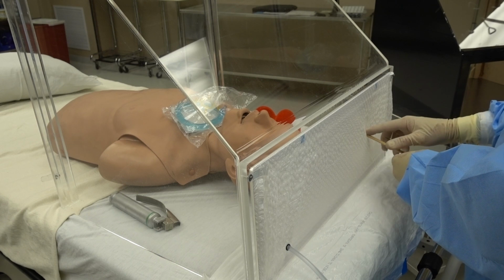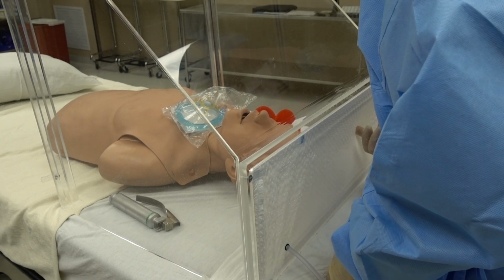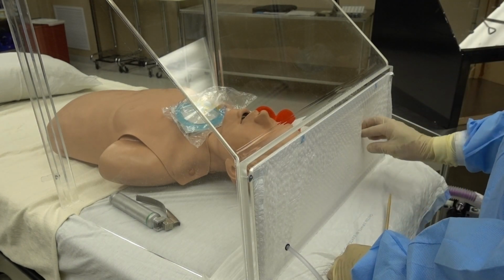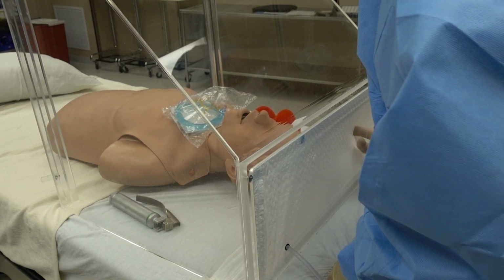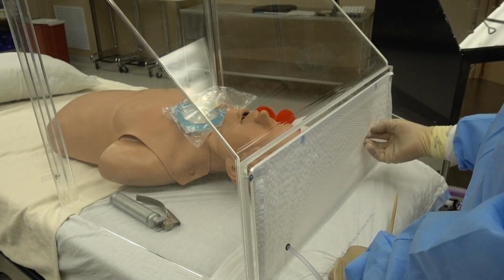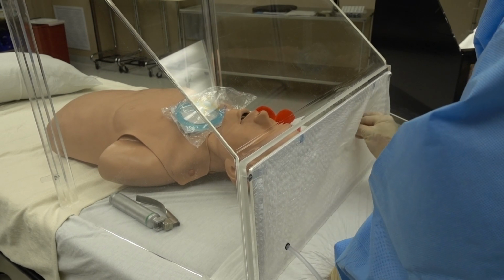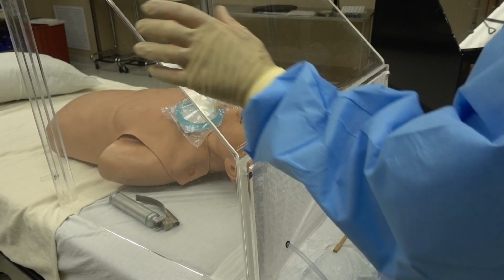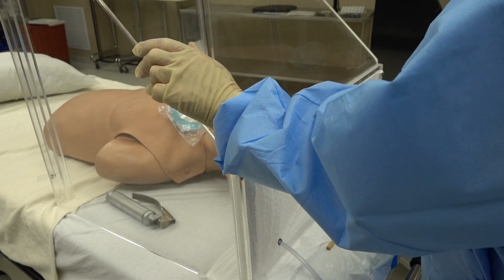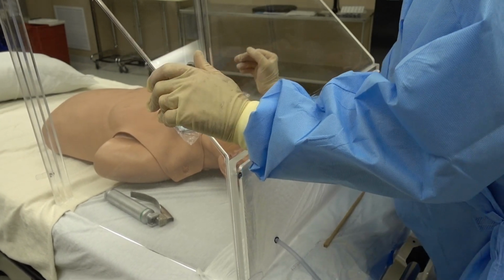But you can pull this out and put your finger right through that hole, and you can see it in there. I don't know if you can see it there, but you put your hand together and you literally just wiggle it in there. So I got a finger in there now. Now you put your whole hand together and work your whole hand through there. And you won't tear this out. They're amazingly strong. So you go in, work your way in, got your hand in, you want to go all the way up to your elbow.